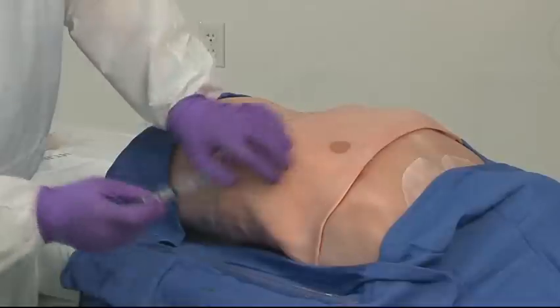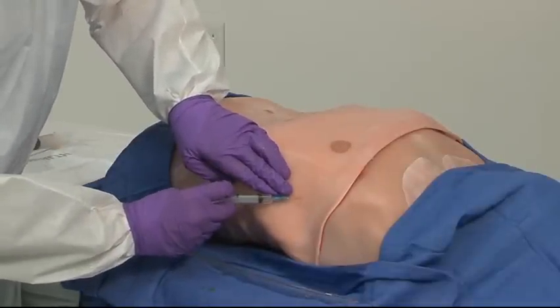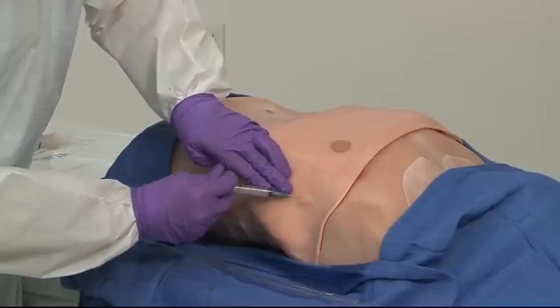If your patient is awake or conscious, it's a good idea to use some local anesthesia, as this can be a very painful procedure. Generally, we like to use some lidocaine with epinephrine, and we're going to infiltrate the skin over the area of the landmark, which is about the 4th or 5th intercostal space, just anterior to the mid-axillary line. I'm going to raise a little bit of wheal.